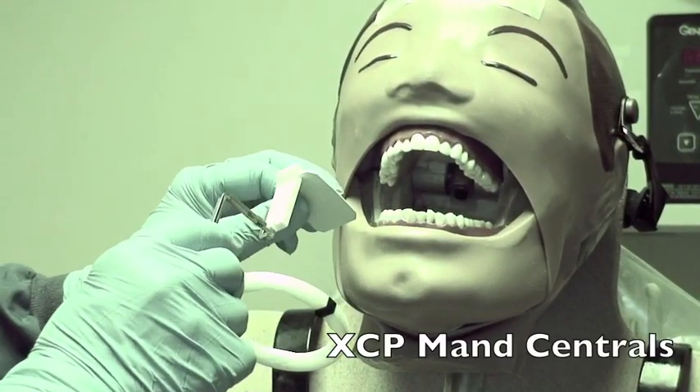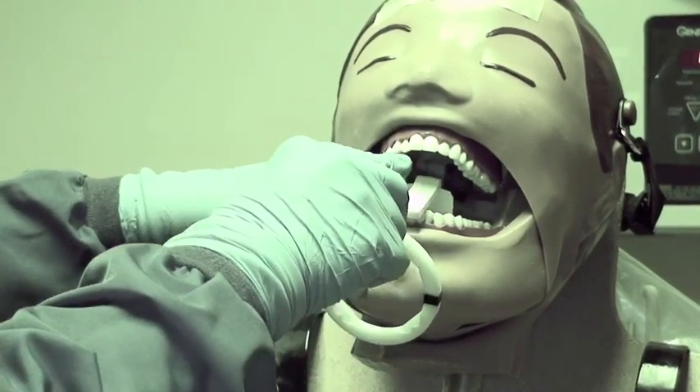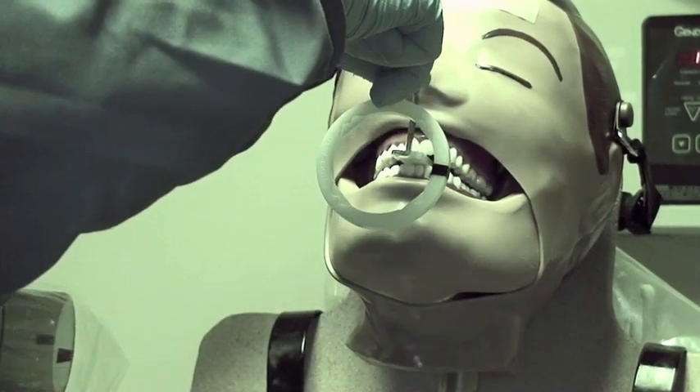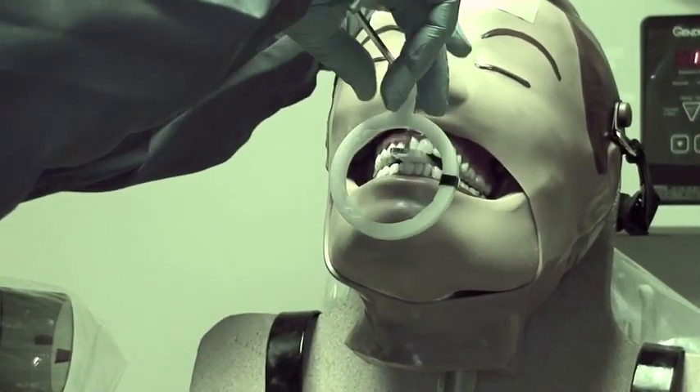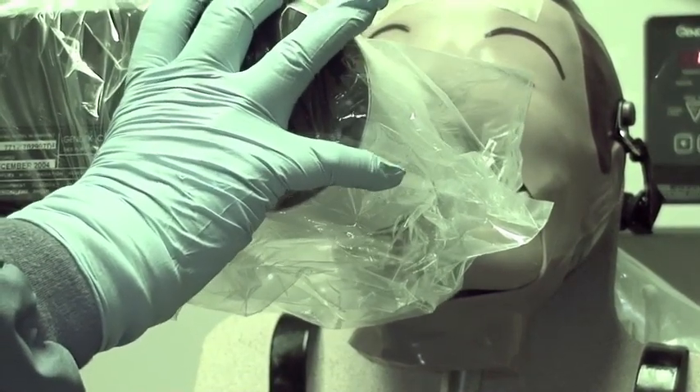For the mandibular centrals, put the dot in the holder and center it back at the molar — you'll be pushing against the person's tongue. As they bite, bring the ring up and move it in. Then line up your PID parallel to the holder.